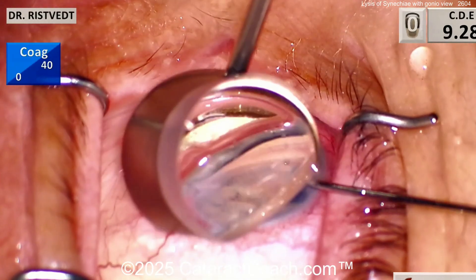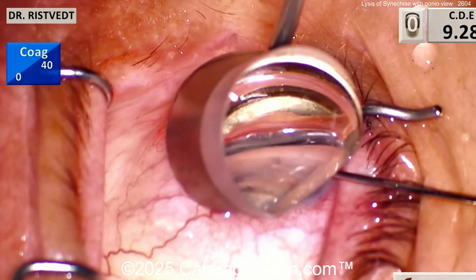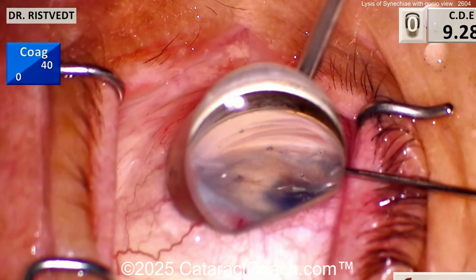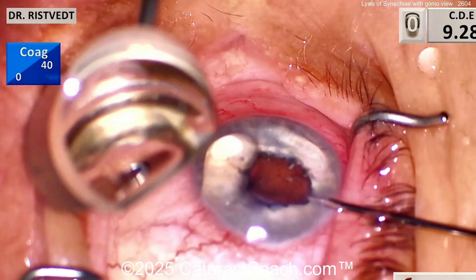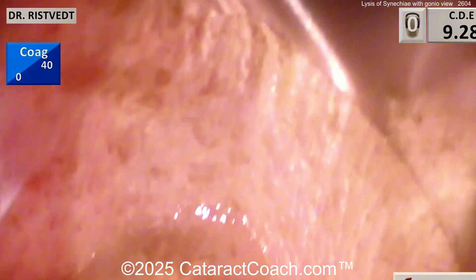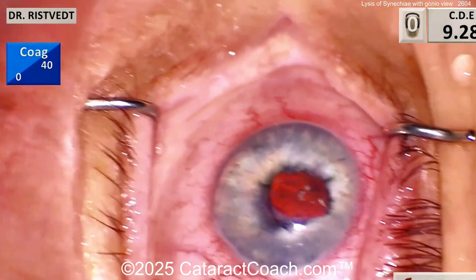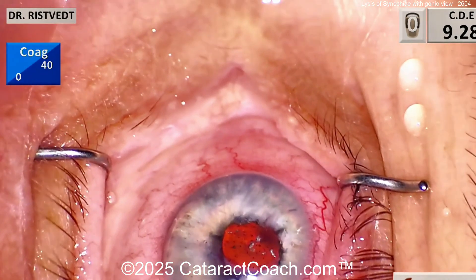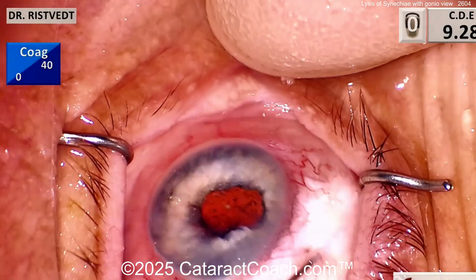Look at this - switching hands. This is why I tell you: if you're a good anterior segment surgeon, you will learn to use both hands at just about the same level of dexterity. That means when you're eating dinner, use your non-dominant hand; when you're brushing your teeth or shaving, use your non-dominant hand - to build up that dexterity. Here at the end of the case it looks pretty dang good, having done that gonio prism analysis and view of the angles.